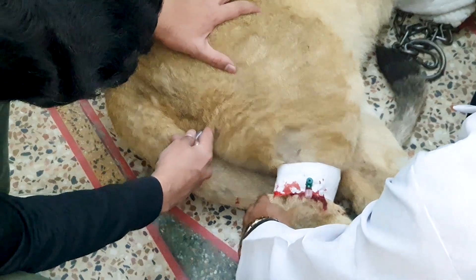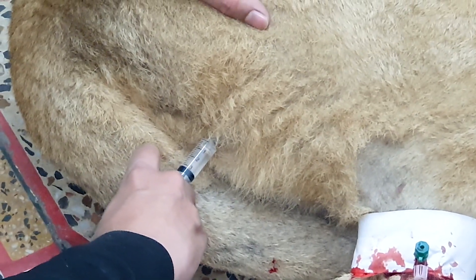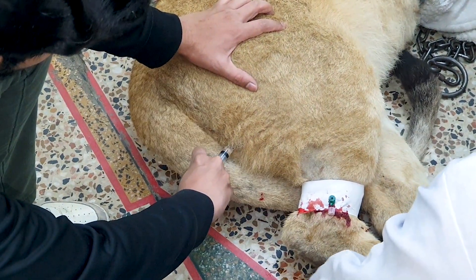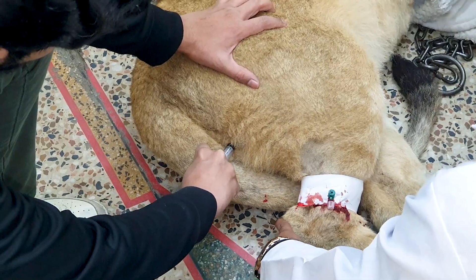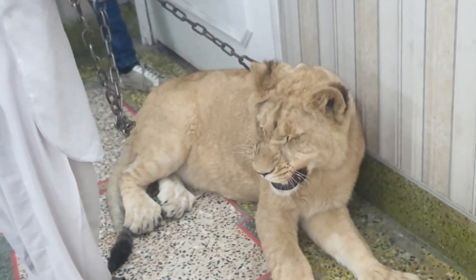There is a belly between these two muscles. We will palpate it with our fingers and then administer the injection. You can either inject into the semimembranosus muscle or the semitendinosus muscle, or the belly between these two muscles can also be used for administration.